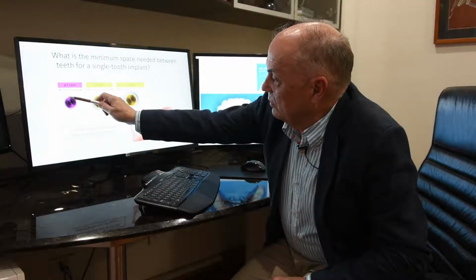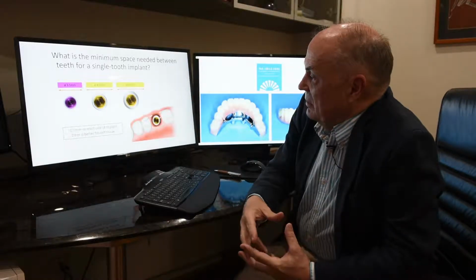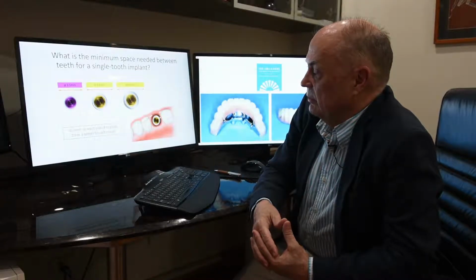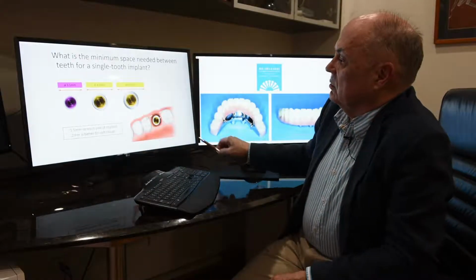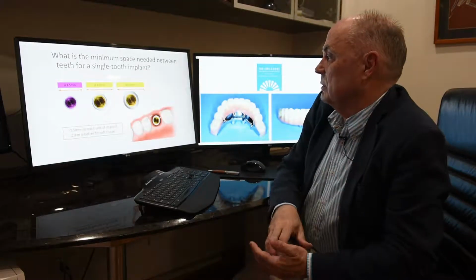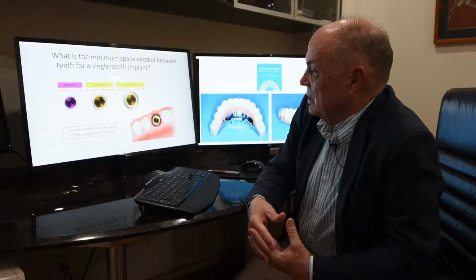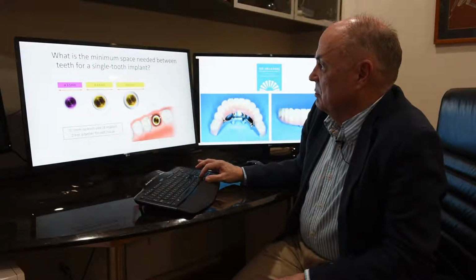The trouble is with a 3.5mm implant, you actually have more bone around the implant, but the walls of the implant get very thin, and so the implant can fracture with a heavily loaded molar over time, and also the screw can come loose and break because the screw is slightly smaller and this connecting interface is smaller. So there are prosthetic complications with going too small, and there are also biological complications by using up all the bone and getting too close to the teeth if you go too big. So all these factors have to be considered when the implant is planned.